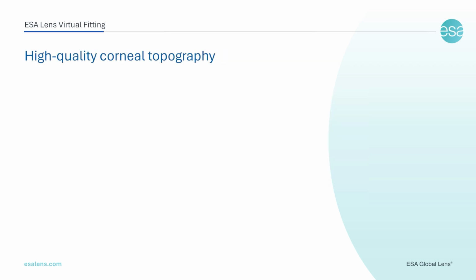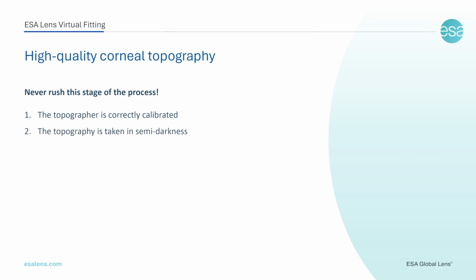The quality of the virtual fit is directly proportional to the quality of the topography. Never rush this stage of the process. To ensure the highest accuracy, follow these 5 clinical requirements. 1. The topographer is correctly calibrated. 2. The topography is taken in semi-darkness.